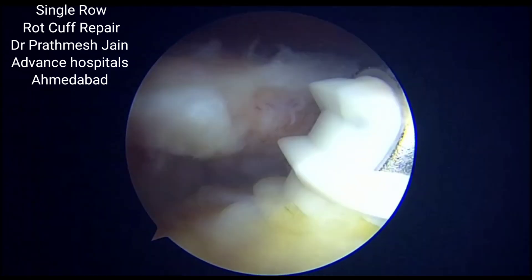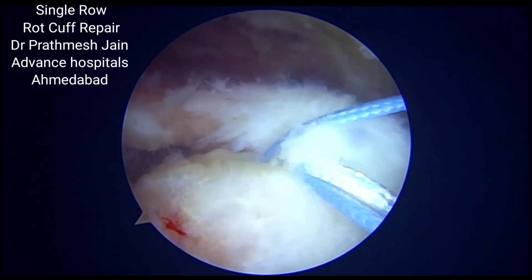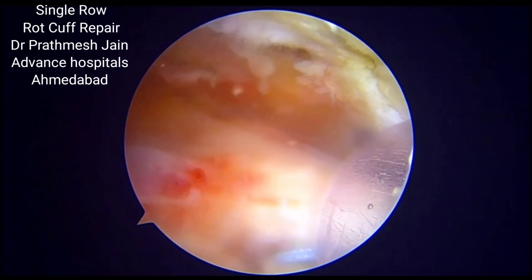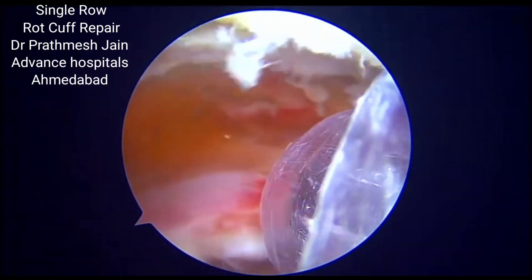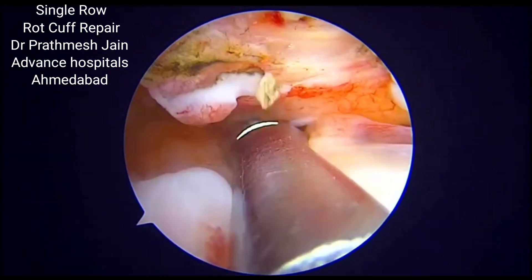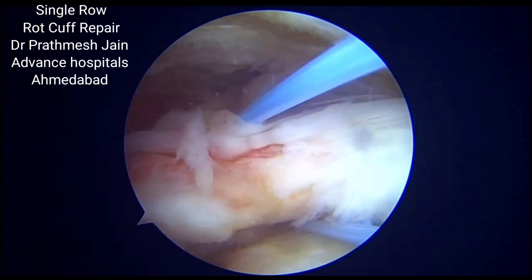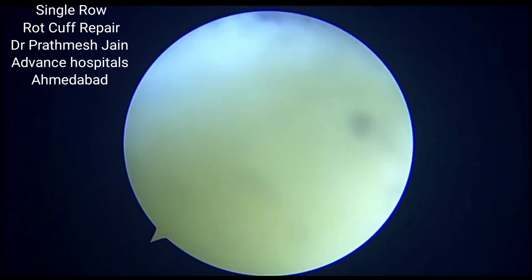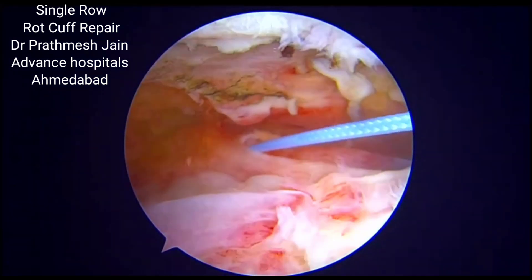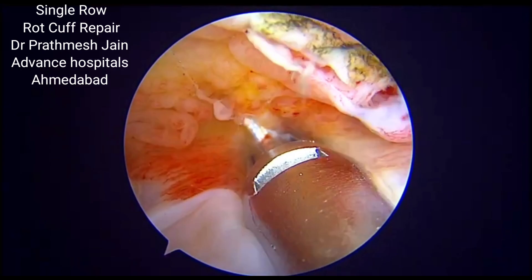Here we are using a helicoil suture anchor to repair it in a single row fashion. By single row, we mean we need to pass an anchor between the middle and the lateral row and we need to pass three suture limbs through the cuff. The center suture limb will serve as a simple suture and the two other suture limbs passing through the cuff will serve as a mattress suture. So this will be a Mason Allen configuration.